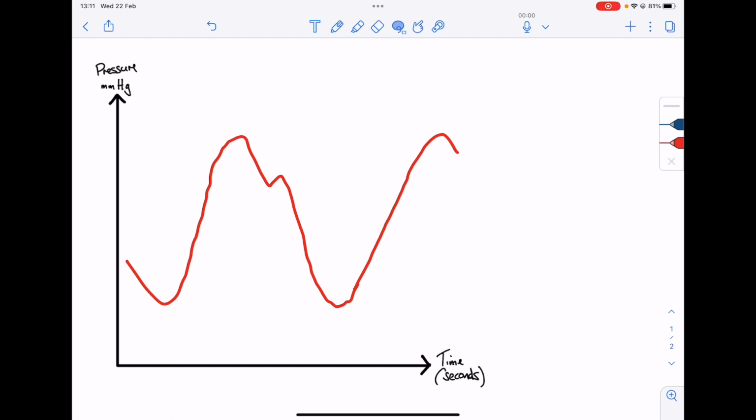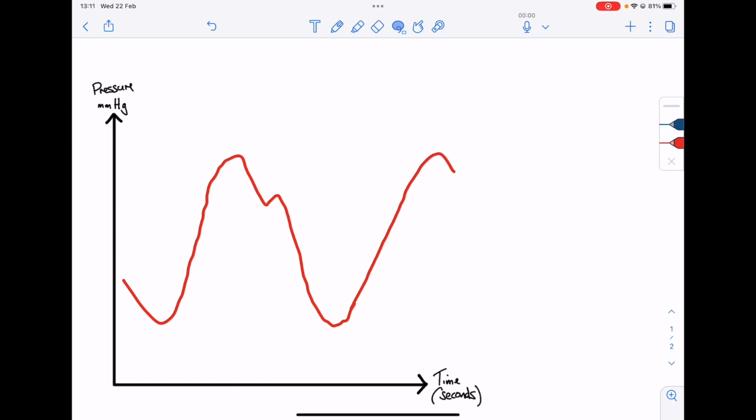Today, we are going to have a look at the arterial line waveform. Hopefully everyone's reasonably familiar with this. There are a number of things to talk about, particularly how it relates to the hemodynamics currently going on inside your patient. As with any Viva question, you draw a diagram first and then progressively discuss features of it as you go along.